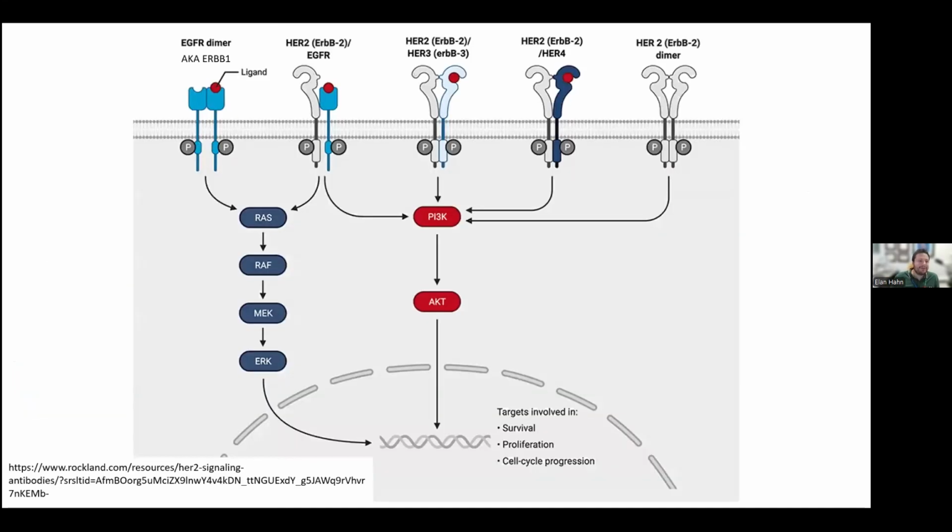So at this point, I was sort of chalking it up to similarities in function between these two genes. EGFR is also known as ERBB1. They're very similar in function to HER2. So, similar pathway involvement, potentially clearly oncogenic. It's at a very good, greater than 70% allele frequency. So I was happy that this was oncogenic and likely driving this tumor.